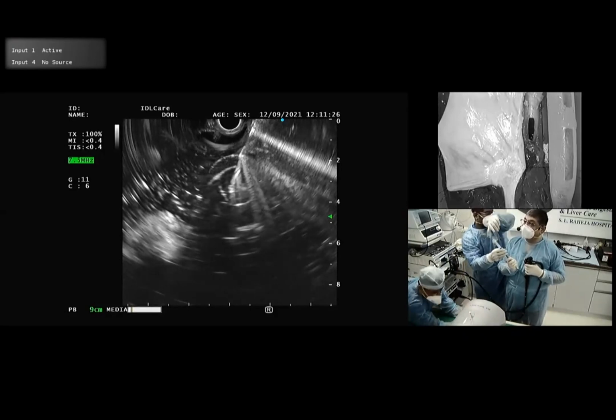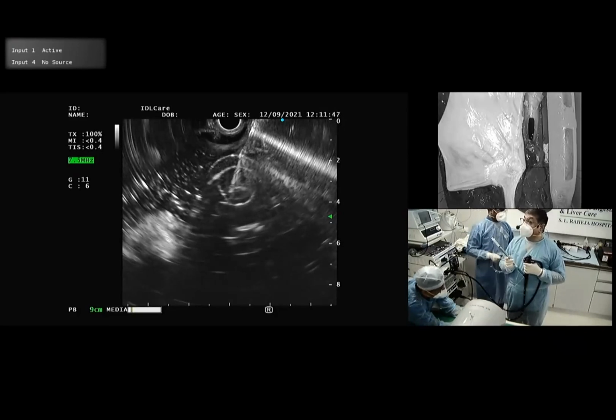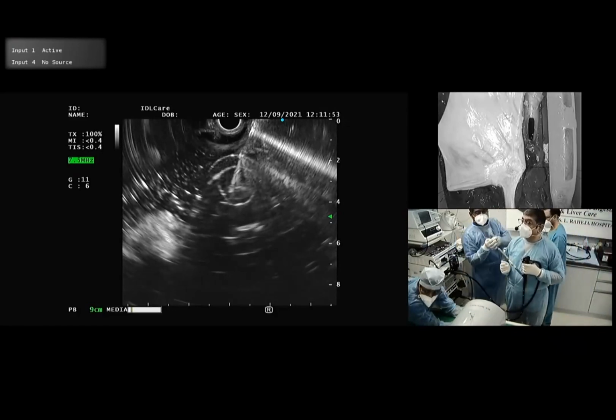Now you should practice passing the guide wire. You can use a Terumo or you can use a VisiGlide because here the bile duct is very, very wide. So we are going to use, what are we using, Bibin? Okay. So we are using a Hydra Jagwire. You will see the problems of wire shearing like real life. You will see how to manipulate the wire. Practice a lot of things on this.